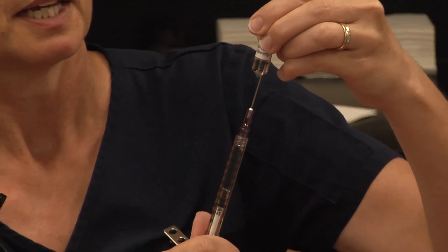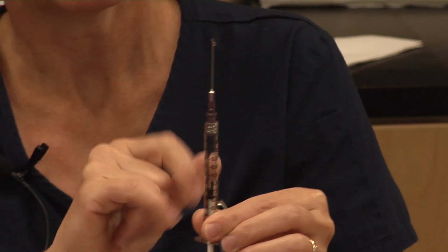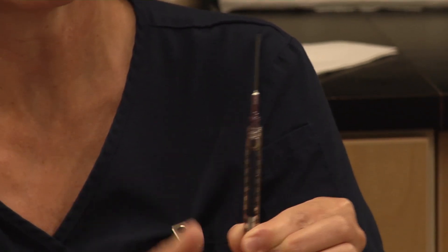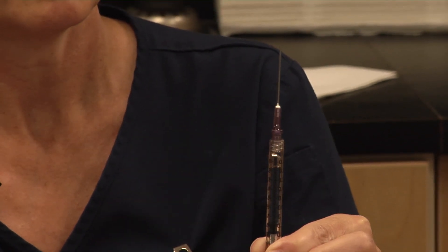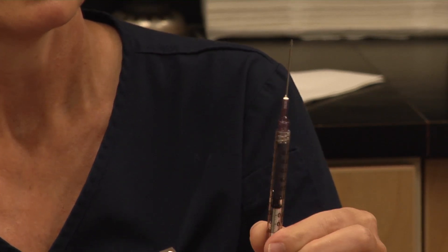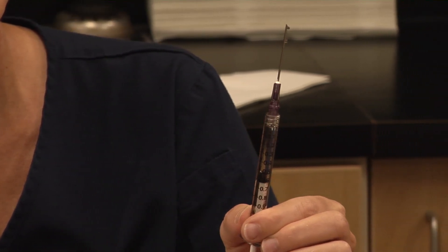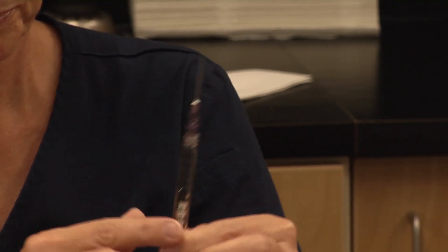There's a little air bubble in the syringe — some syringes do that more than others. Pull down a little bit and flick to displace the air bubble. When the air bubble reaches the top, pull back just a smidge to empty the hub, then correct your dose. If this were a narcotic like morphine or fentanyl, I'd have to declare I'm wasting some, because narcotics are controlled substances.